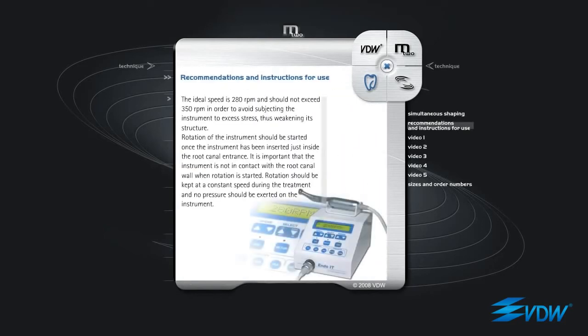Recommendations and instructions for use: the ideal speed is 280 rpm and should not exceed 350 rpm, in order to avoid subjecting the instrument to excess stress, thus weakening its structure. Rotation of the instrument should be started once the instrument has been inserted just inside the root canal entrance. It is important that the instrument is not in contact with the root canal wall when rotation is started. Rotation should be kept at a constant speed during the treatment and no pressure should be exerted on the instrument.